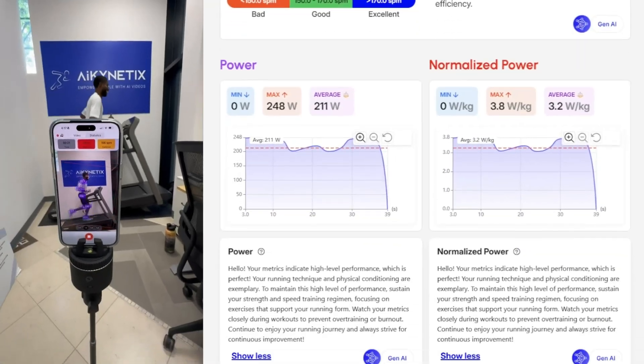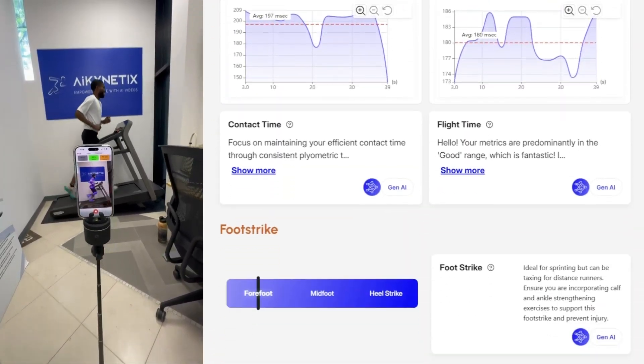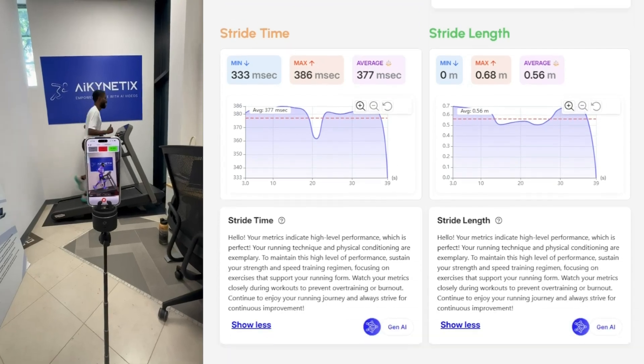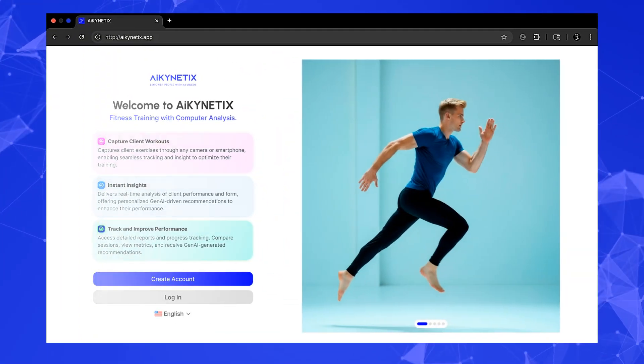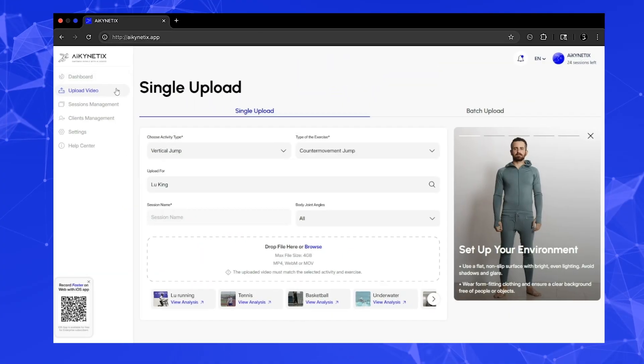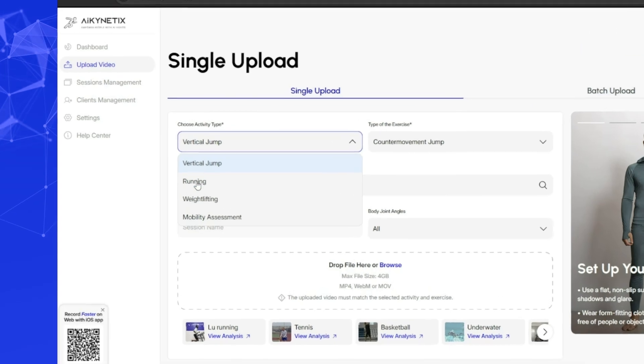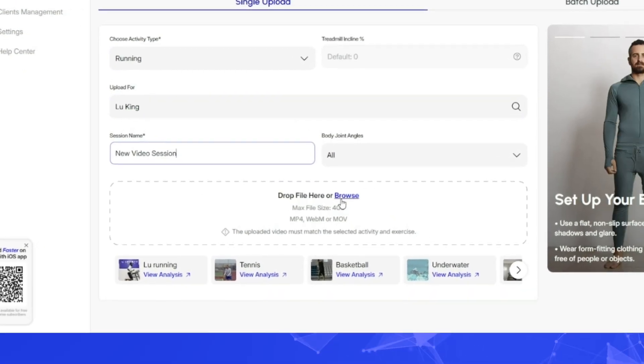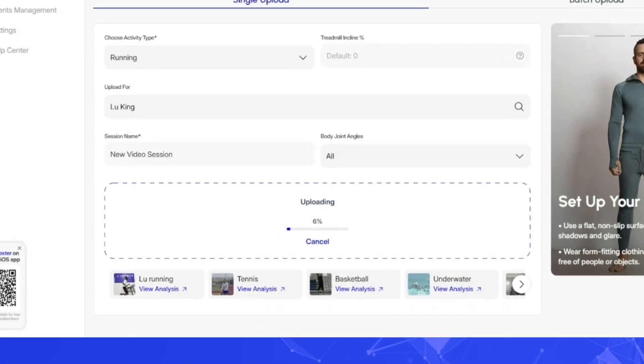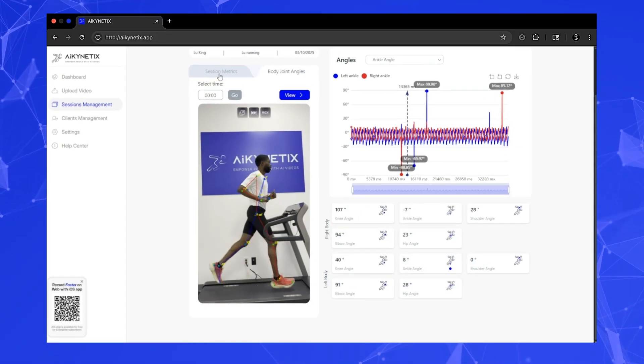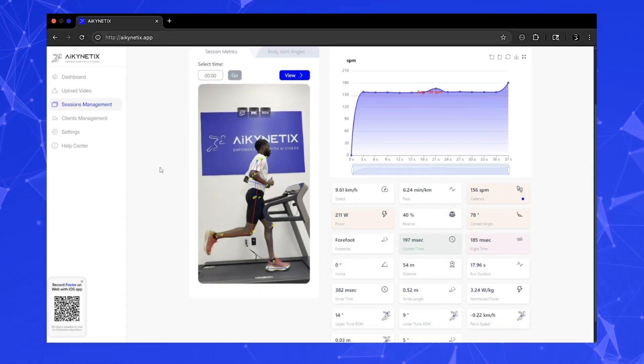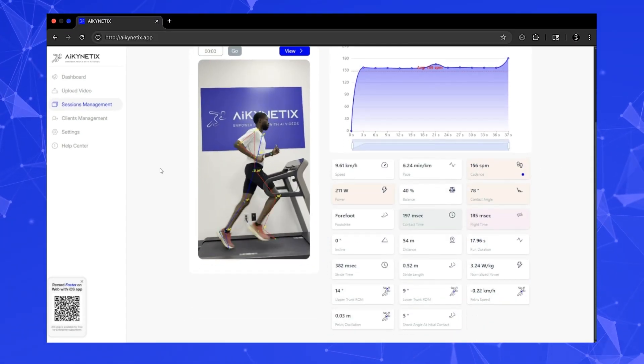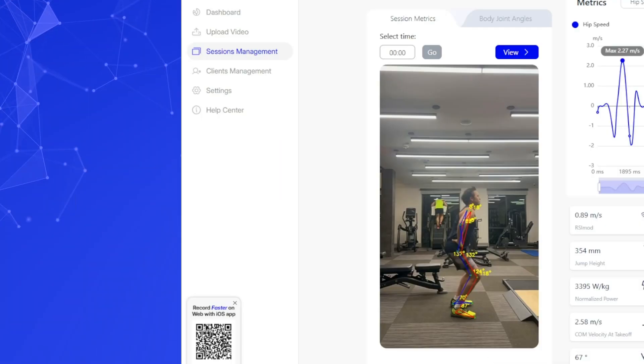What if you could bring the power of biomechanics anywhere, using just the phone in your pocket? This is AI Kinetics. It's a web platform that uses artificial intelligence and computer vision to transform a simple smartphone video into a detailed biomechanical report. Within about a minute, it automatically calculates key metrics that were once locked in the lab.